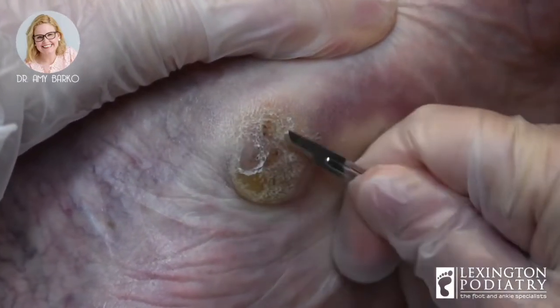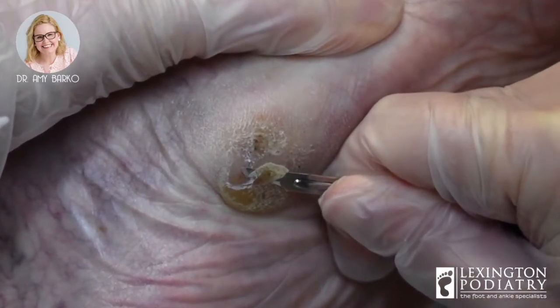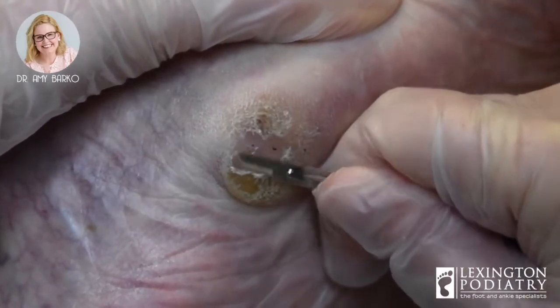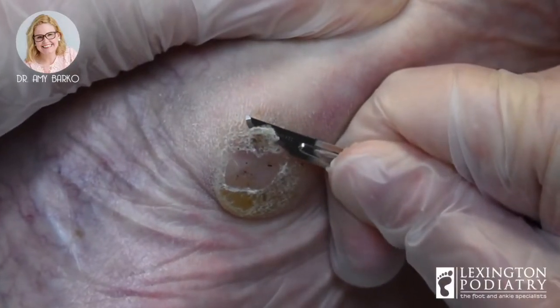Now sometimes when you trim calluses, I don't know if you all can see the black dots in her callus. That is blood. It's not fresh blood, it's old blood. But it's from so much pressure.